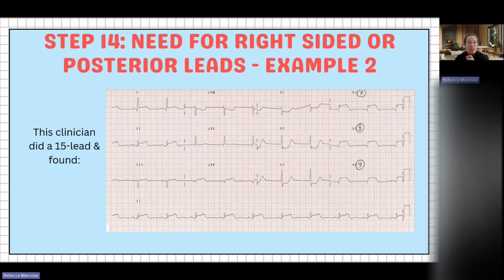So this clinician did do the posterior leads, V7, V8, V9. And you can see here what they look like. They do have significant ST elevation on the posterior side. They're having an inferior posterior MI.